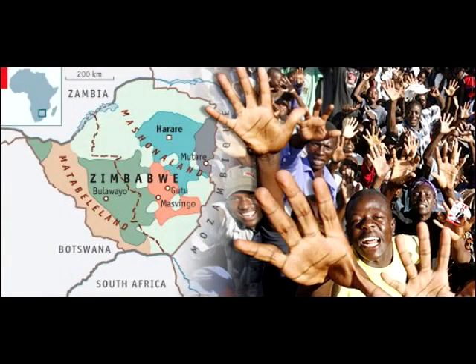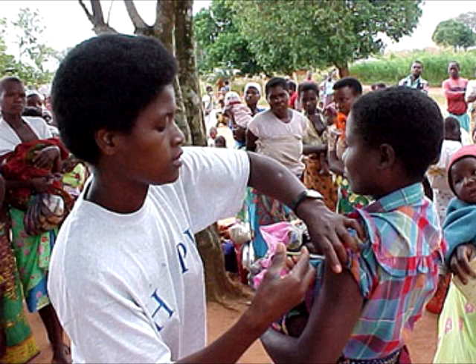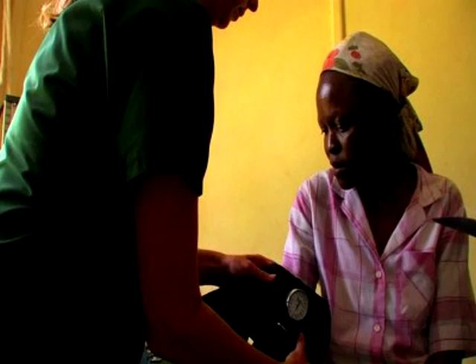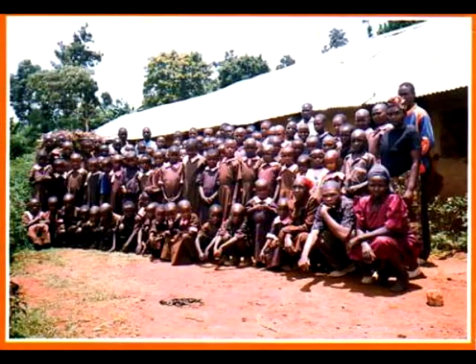In developing nations such as Zimbabwe, the patient-to-doctor ratio is 22,000 to 1. Even with ample volunteers, patients are still underserved. To properly diagnose a person with this condition, it requires 3 measurements within a 3-month span. This makes diagnosing patients for high blood pressure virtually impossible without self-monitoring within communities.